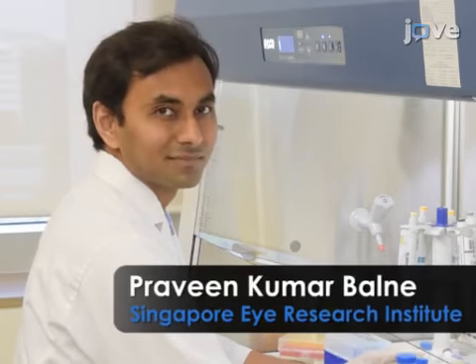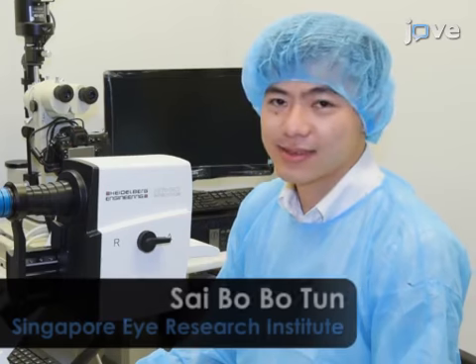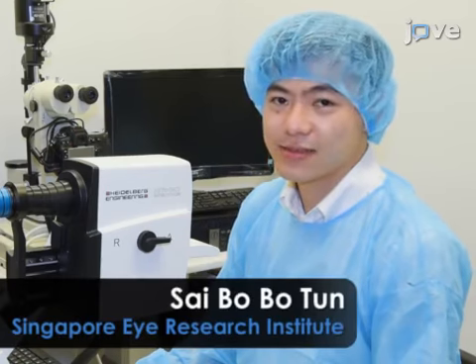The main advantage of this technique is that it can be applied to different disease phenotypes, and it is also very easy to perform. This procedure will be demonstrated by our team members Praveen, Bobo, and Neha.